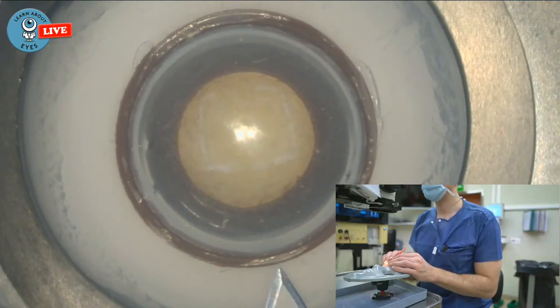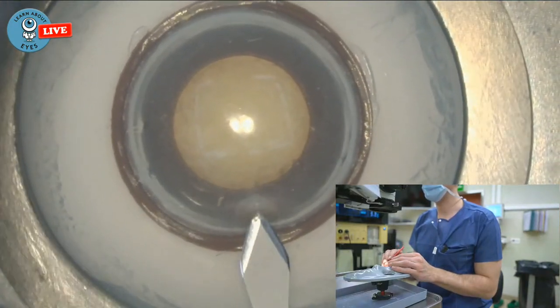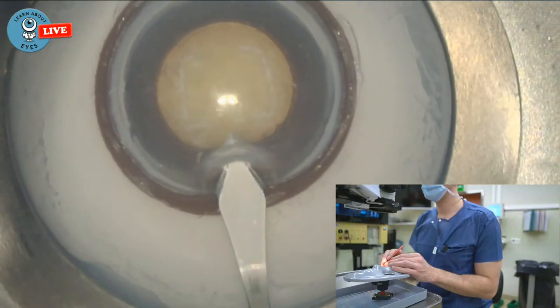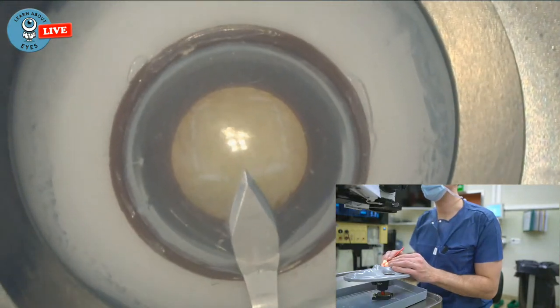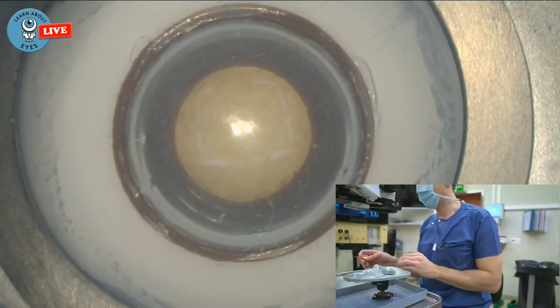And then using the knife to construct our tunnel. This knife has definitely been used quite a lot. It's not that sharp anymore.